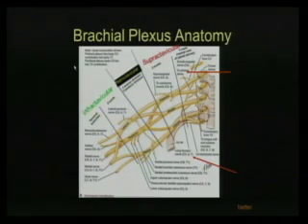And then if you go over to the axial image, you see the dorsal ramus comes off and does the paraspinal musculature and skin like we mentioned. And then if you can move this up into the neck, you could see that the ventral ramus comes off and would go down the arm. So that's kind of, again, just starting with the basics.